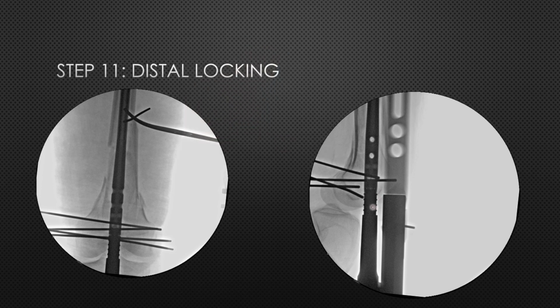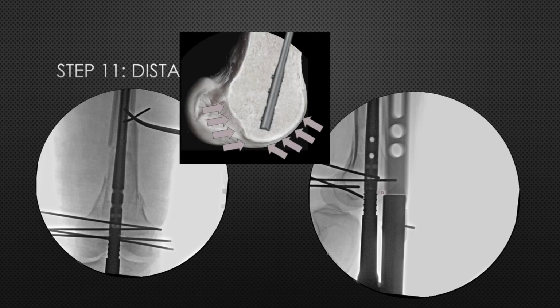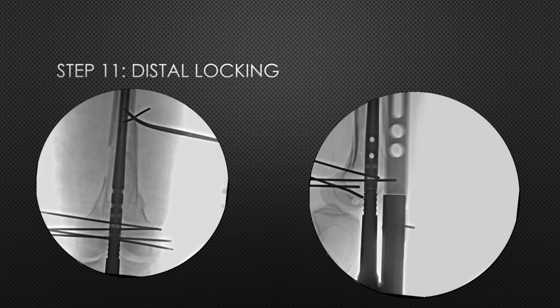So you have to see the junction of your jig insertion and this dip inside the nail. So the nail end is here. So this end should be above this faint line of the trochlea and should be above the terminal part of the Blumensaat line. If it is ending below the level of these faint lines, that means your nail is inside the joint. So you have to ensure that it has passed these lines whenever you are committing for distal fixation.